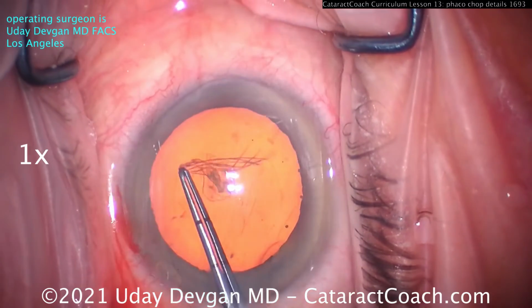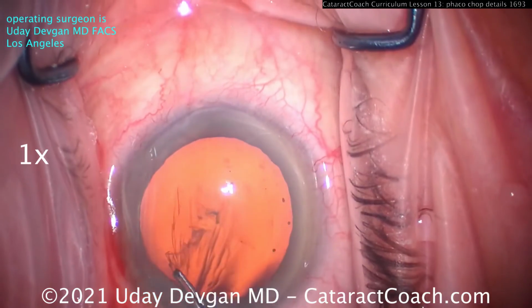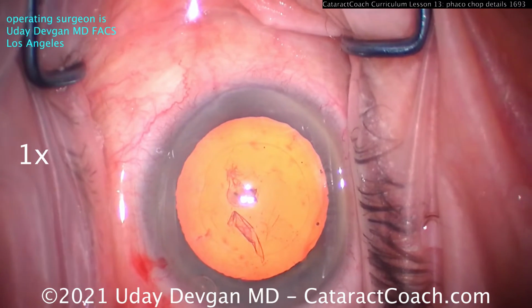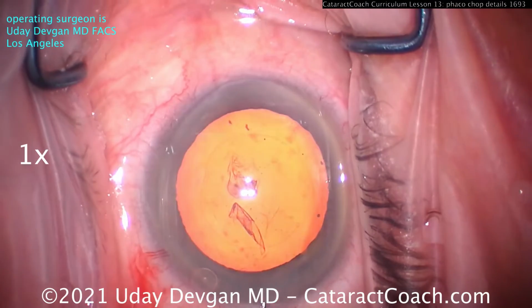Now I have to show you the capsulorhexis because to do this technique, you really need to have a 5 millimeter to 5.5 millimeter diameter capsulorhexis. Do not make a baby capsulorhexis. If you have a 4 millimeter capsulorhexis, you won't succeed with this technique.